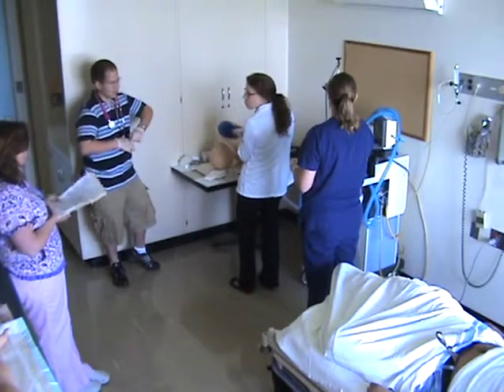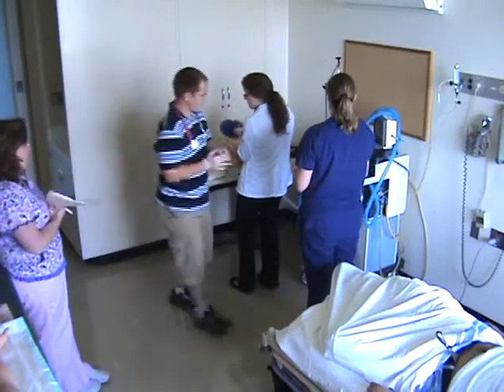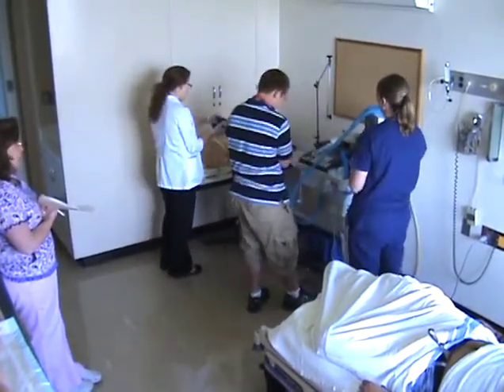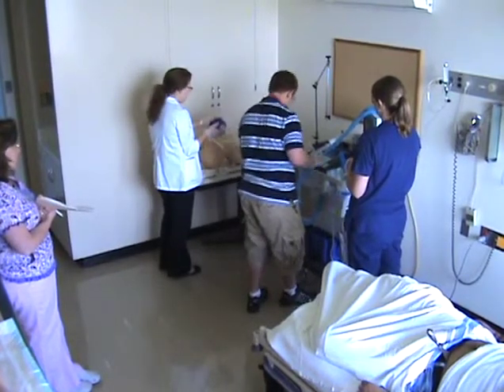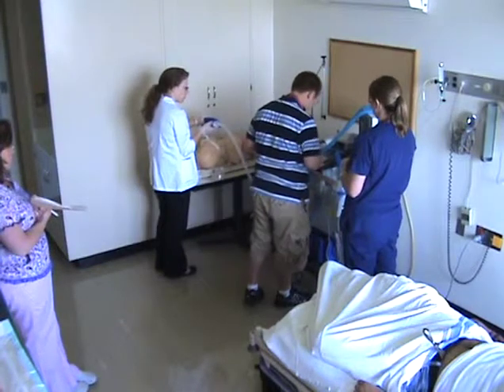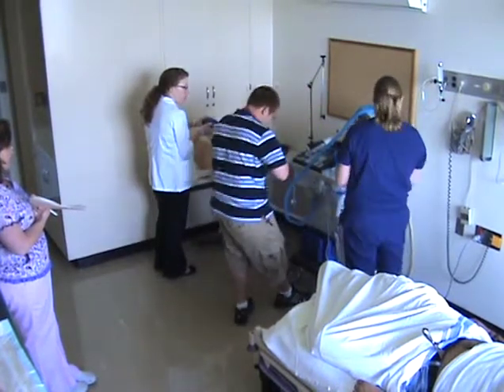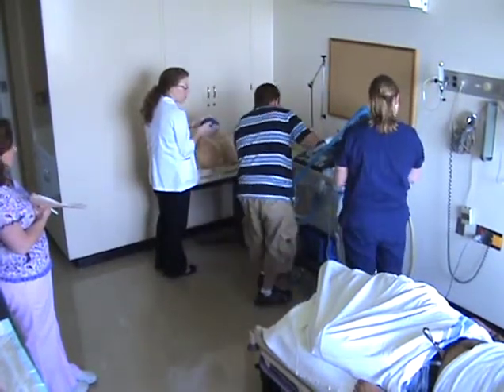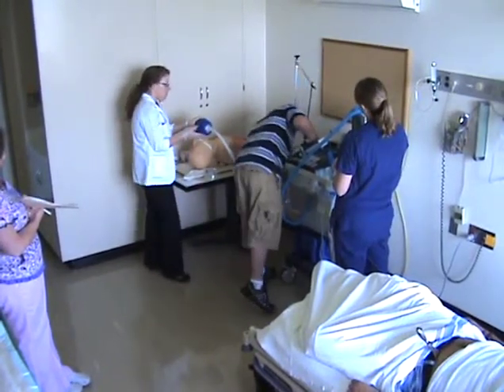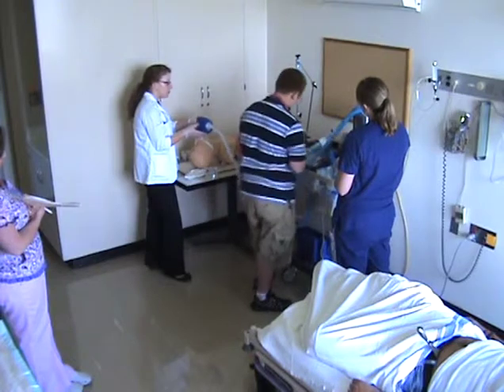All right, so since you're the respiratory therapist, we'll let you go ahead and hook it up and get the patient. You can tell me what you need to look at. We'll look at the ABGs and serial ABGs. Here we go.